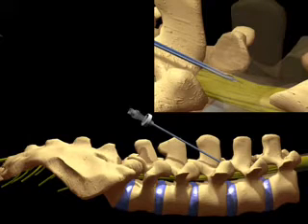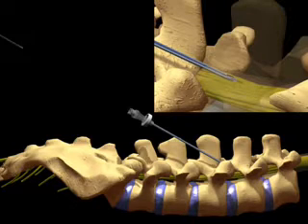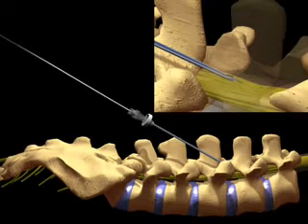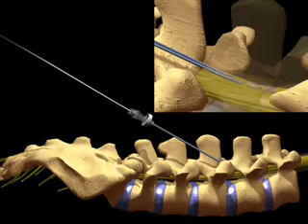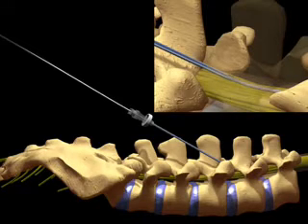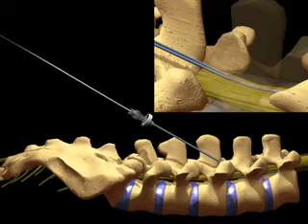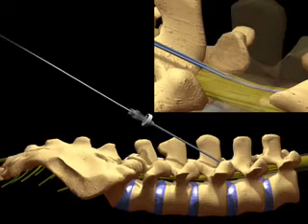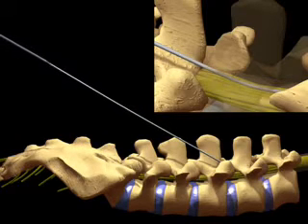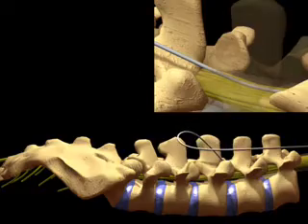With paramedian oblique needle placement, a minimal bend in the catheter eases guide wire removal and decreases the chance that the catheter will be damaged or kinked at or near the entry site in the lumbodorsal fascia. Passage of the catheter through the paraspinous muscles for one to one and a half vertebral levels before piercing the ligamentum flavum and dura may also help prevent catheter dislodgement from the spinal canal.